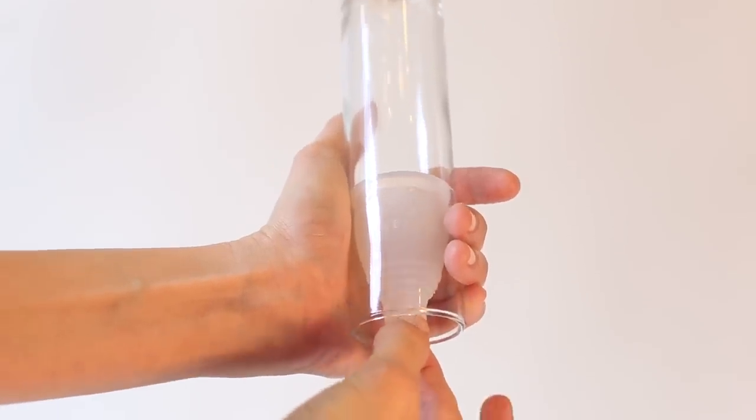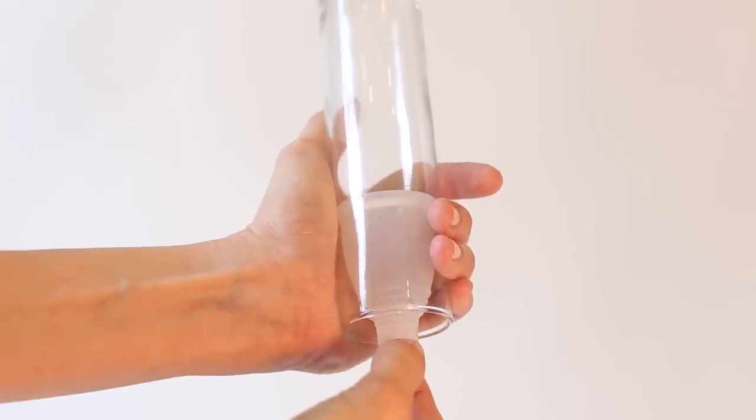You do not want to just yank it out. If you find that you have a high cervix and your cup has migrated up, you can feel for the stem, grip it, and use a gentle wiggle motion to coax it down until you can reach the base. A menstrual cup cannot get lost inside of you — there's nowhere for it to go. The only way for it to go is out.